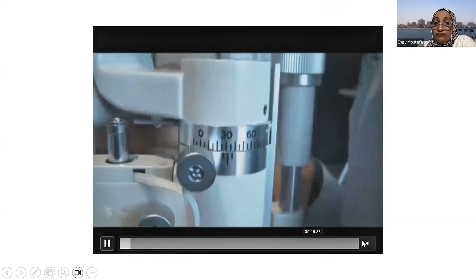So what are we looking for and how are we going to do it? It's the same. It's always like from 30 to 45 degrees according to the patient and according to the angle of your perception. And then you are going to focus on the cornea and narrow the beam. Here is how to narrow the beam on the cornea. This is the cornea, and this is the iris, and the space between them is the anterior chamber.